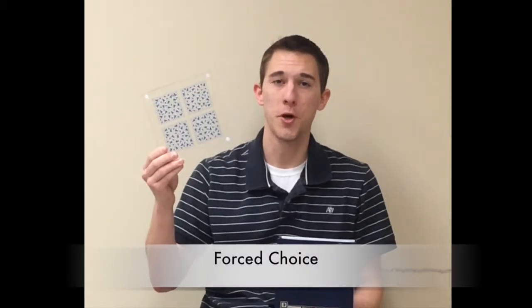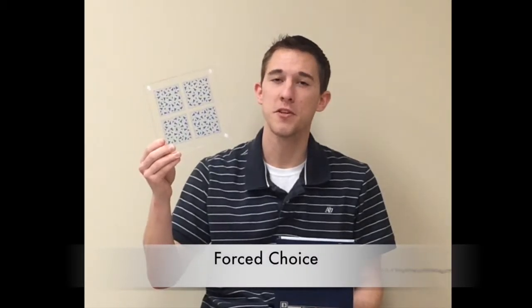This method uses forced choice, so the observer is always required to pick one of the four quadrants which they believe contains that disparity. This is a test of depth perception. Because of the forced choice methodology of this test, there's a guessing rate of 25%, because one of the four quadrants with the disparity can be guessed at that rate.